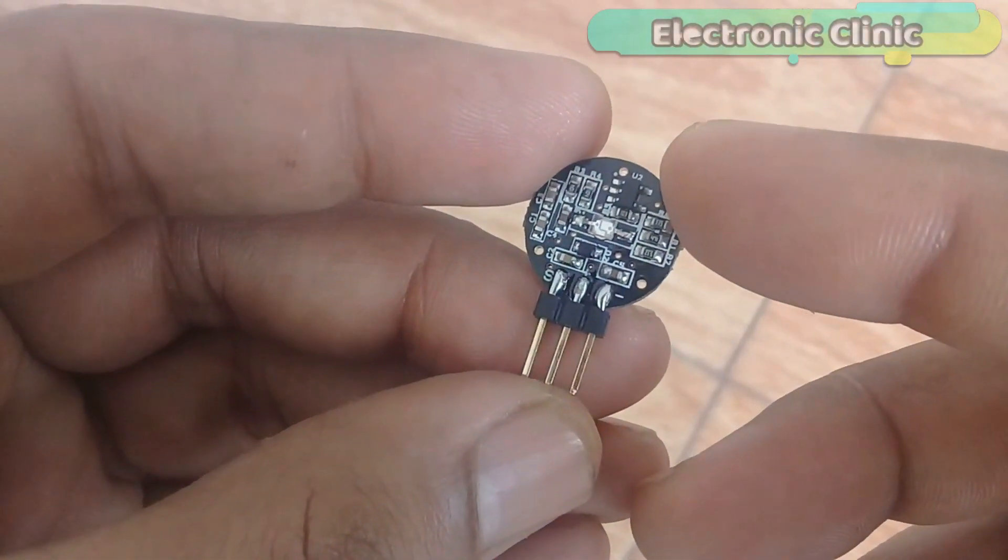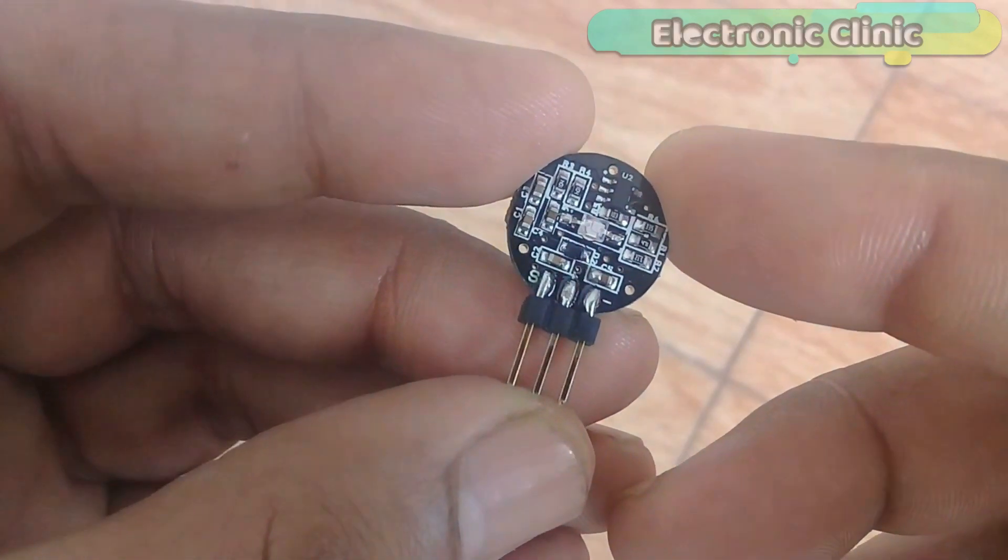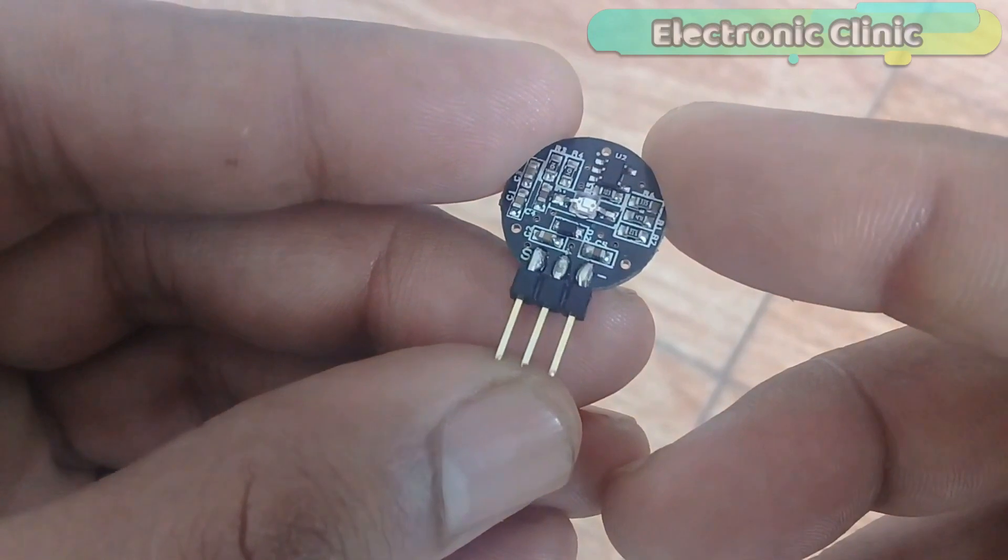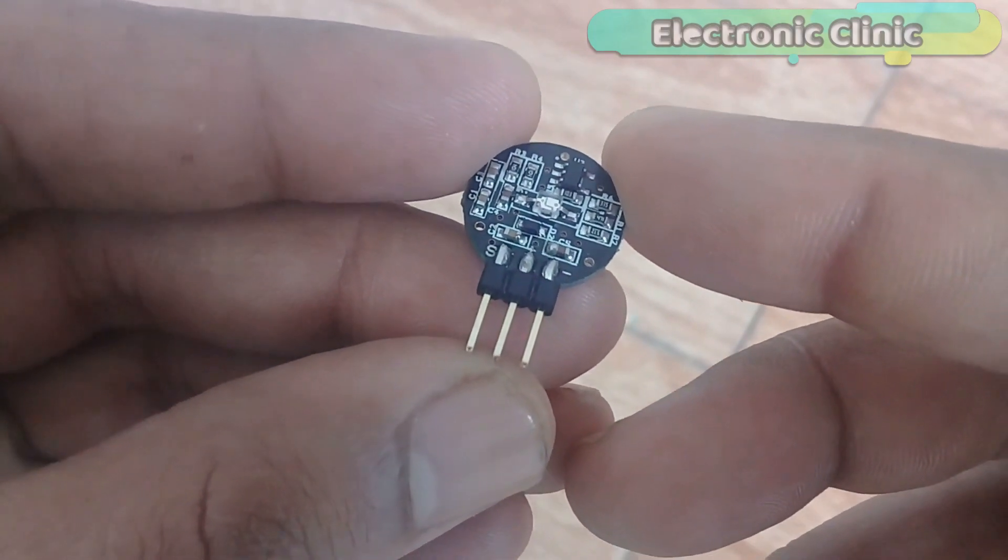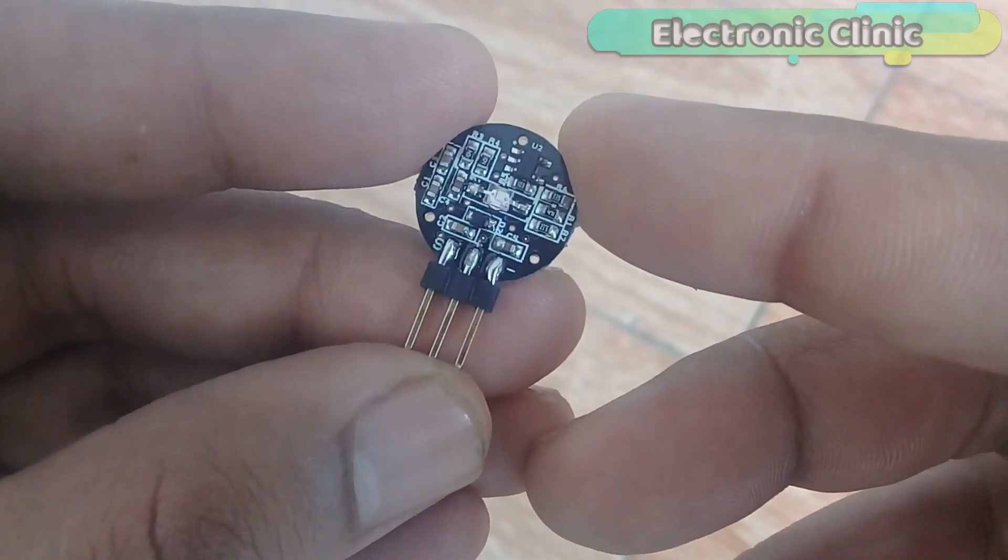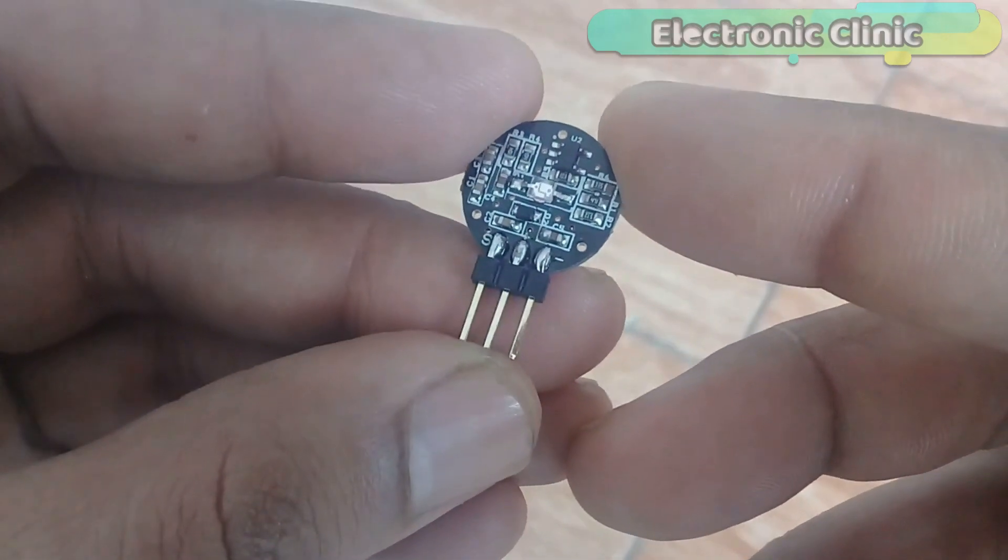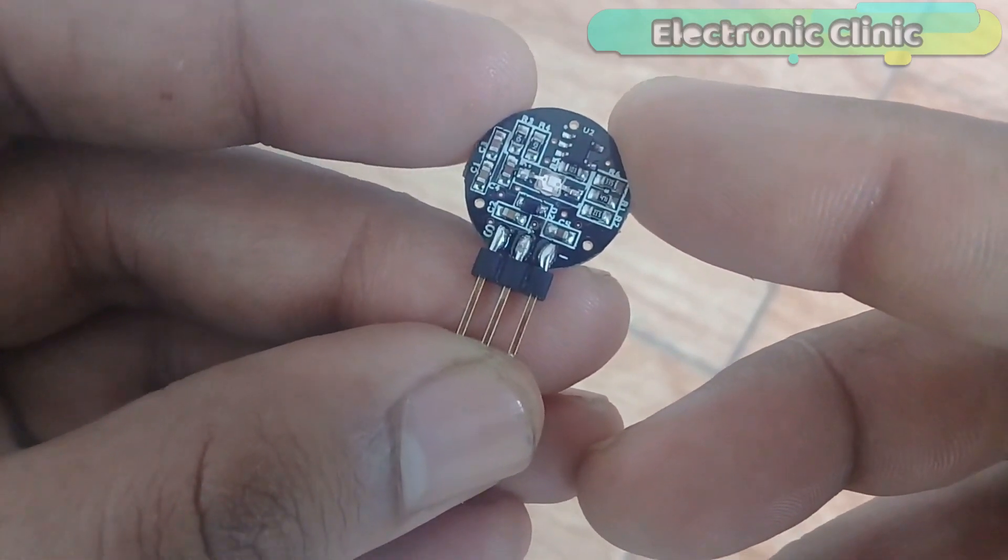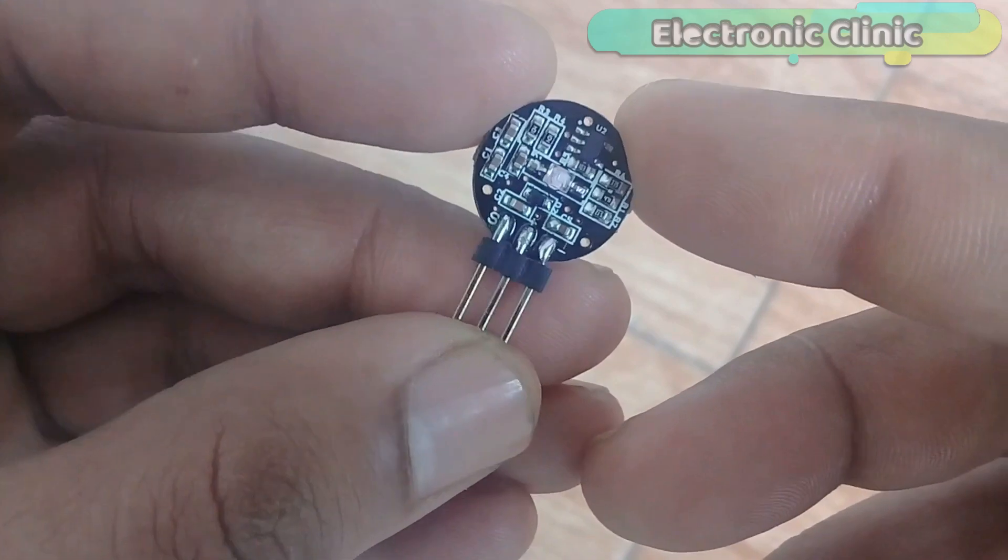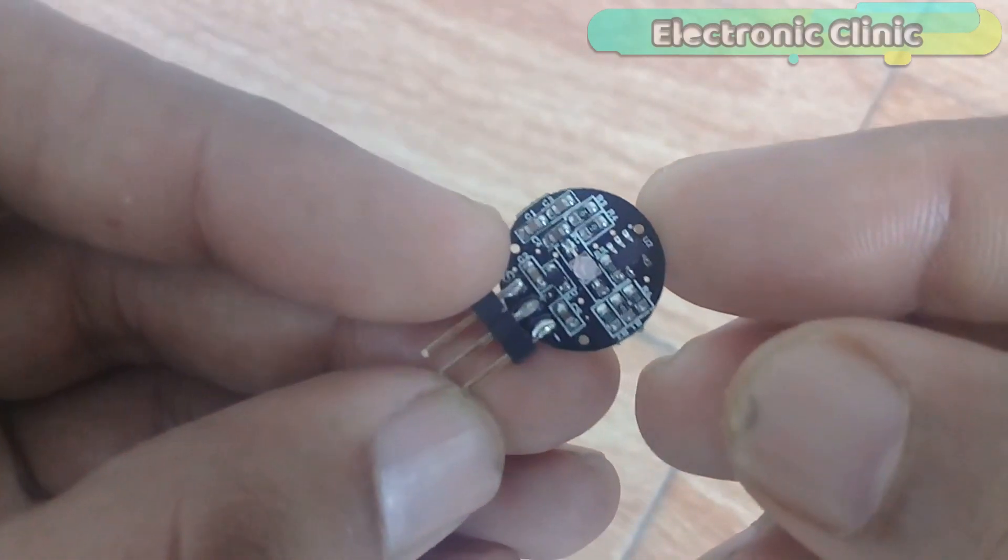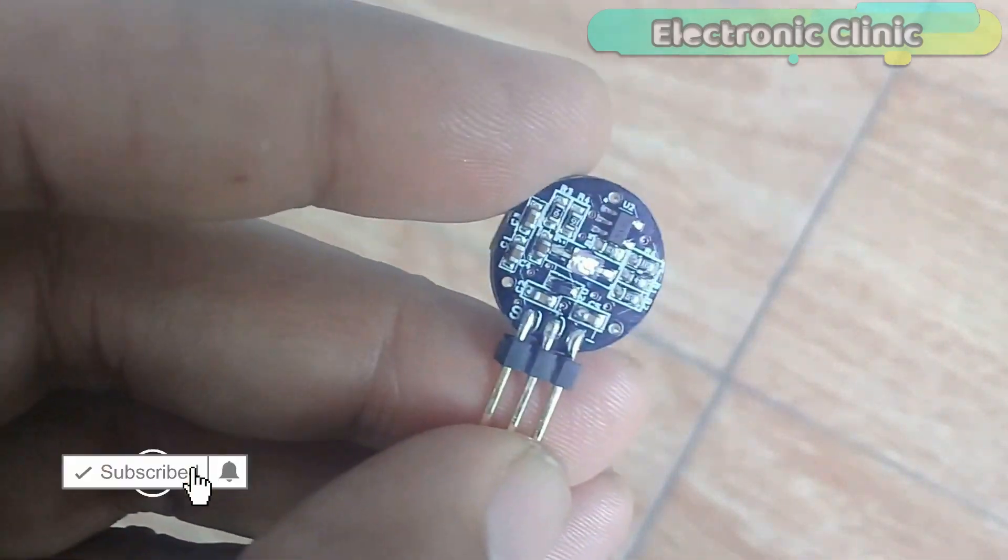As you can see, this pulse sensor has three male headers which are labeled with S, plus and minus. S is the signal pin and will be connected with the analog pin of the Arduino. The plus pin, which is the middle pin, is the VCC pin and this pin will be connected with the Arduino's 3.3 or 5V. While the minus pin is the ground pin and this pin will be connected with the Arduino's ground.